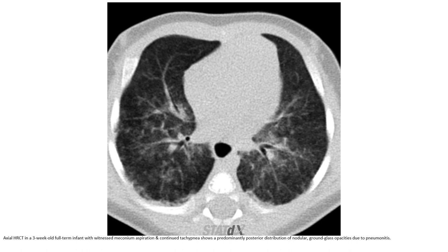A chest CT in a three-day-old term infant with meconium aspiration and tachypnea shows predominantly posterior distribution of nodular, ground-glass, and consolidative opacities due to pneumonitis.